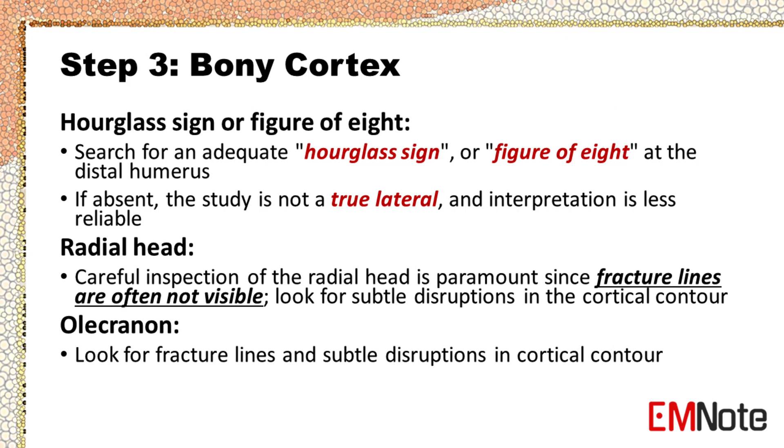Step 3 — Bony Cortex. Check around every bone on the film. Search for an adequate hourglass sign or figure of eight at the distal humerus. If absent, the study is not a true lateral and interpretation is less reliable. Careful inspection of the radial head is paramount since fracture lines are often not visible — look for subtle disruptions in the cortical contour.